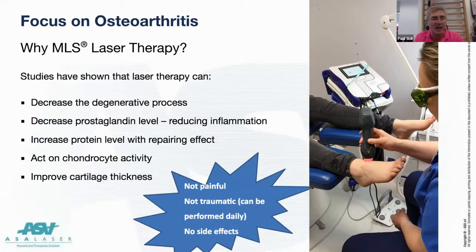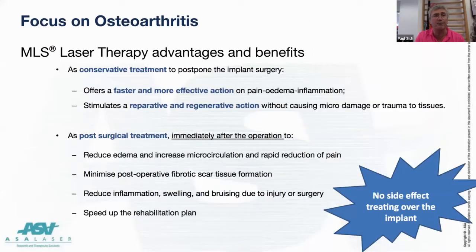And as I've said in every webinar we have, pain is our big enemy. Pain stops people moving. Pain puts people into avoidance. Pain puts people into a spiral downhill. We need to get some movement on these joints. We've got to get that midfoot moving. We've got to get some reparative aspects going on, yes, with the laser, but also just by getting a bit of blood supply and a bit of synovial fluid through there.